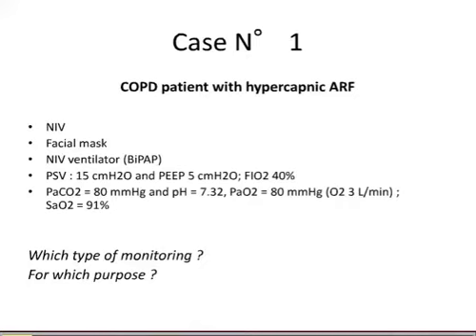May I ask first where the patient is? The patient is in the ICU. He just arrived in the ICU. And this is the first blood gas analysis, just before starting NIV. The neurological status is okay. He's a little confused, sleeping, but he is arousable.